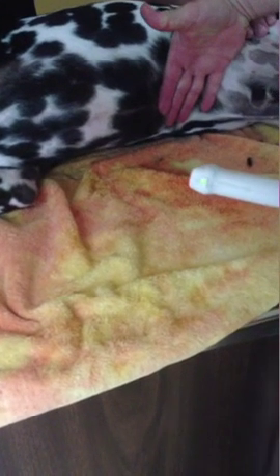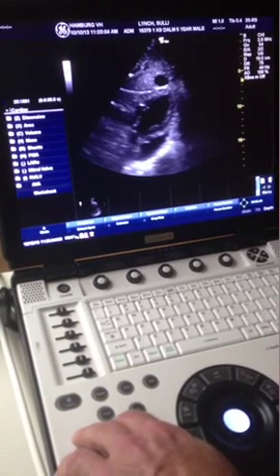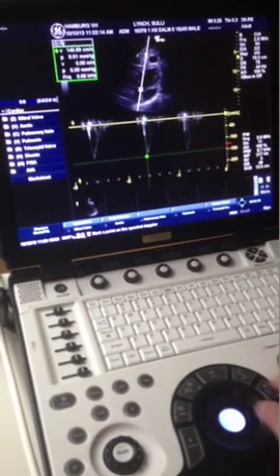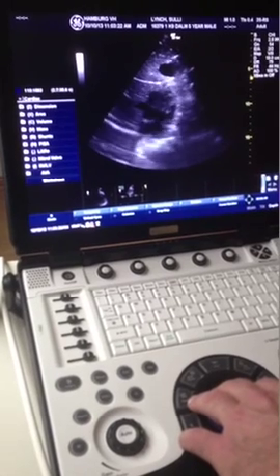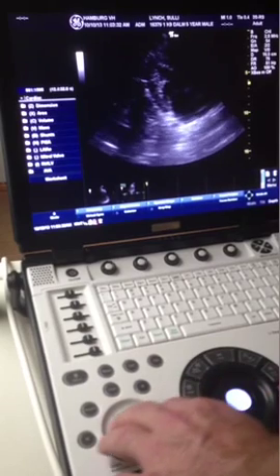The next position is position 4, right under the xiphoid. I use my hand to push against the abdomen and the probe is parallel with the patient. I'll adjust my depth and get the aorta coming right down the middle. There's some mirror image artifact I'm working around, but I have a nice clean aortic envelope. I'm still not happy with the mitral insufficiency jet, so I'll try to work and get an angle from here — but I don't think I'm going to be able to, so I'll try it back on the four-chamber.